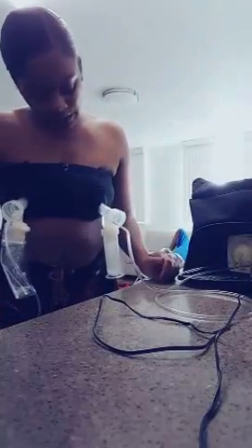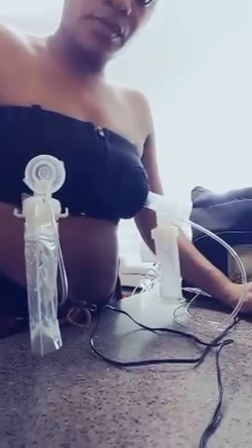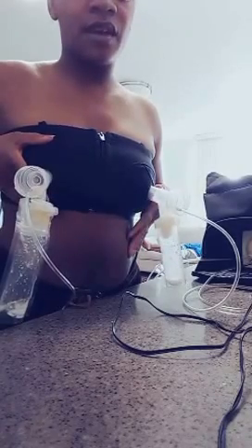So I'm already starting to let down. I don't know if you can tell, but milk is filling in this tube. You can see the milk dropping down, as well as a little bit in the bag here. And usually, stimulation activates the milk letdown. So if baby is feeding on this side, it will usually activate the letdown for this side. If you are pumping on both sides, you're totally stimulated and activate your letdown.